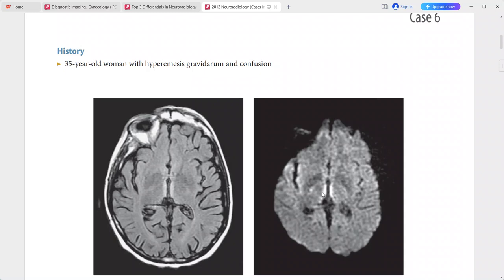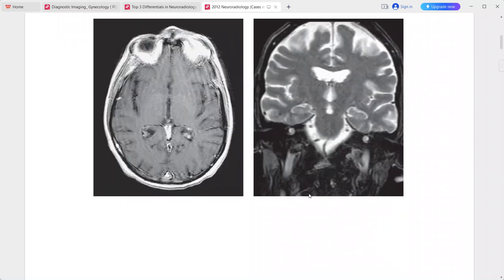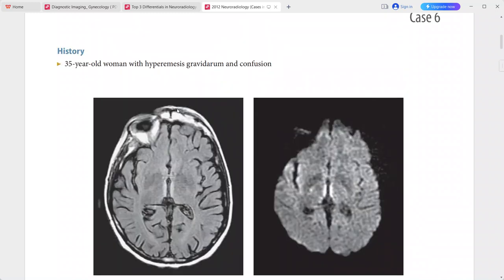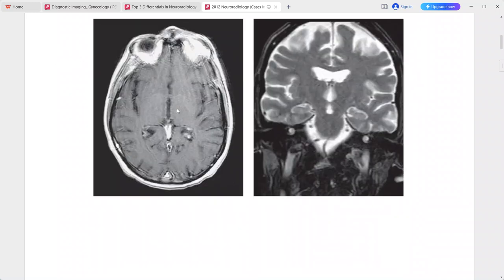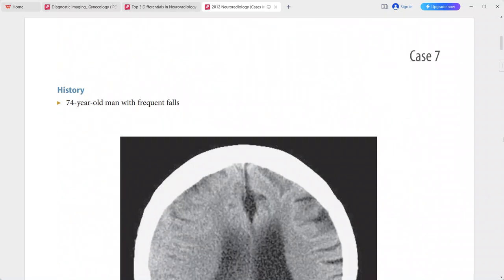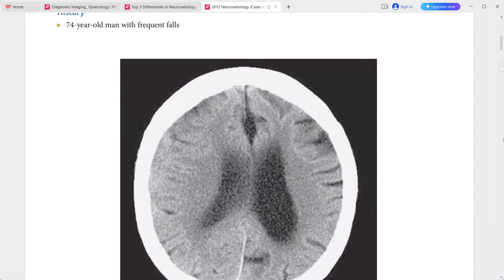The DWI sequence shows restricted diffusion in this area. On contrast-enhanced sequences, there is no enhancement. This is a case of Wernicke's encephalopathy. Differentials include artery of Percheron infarction, internal cerebral vein thrombosis, and viral encephalitis.